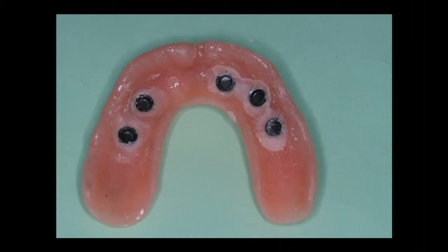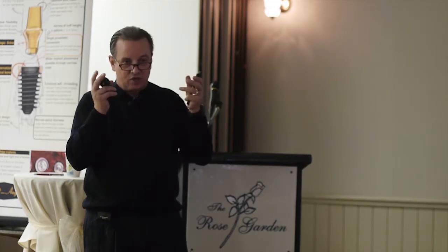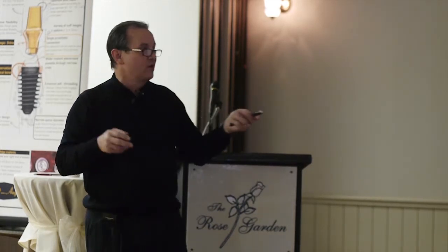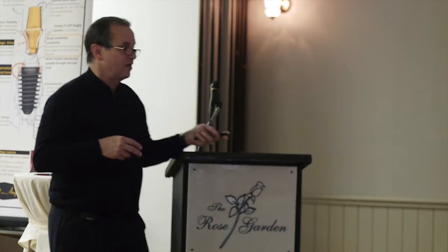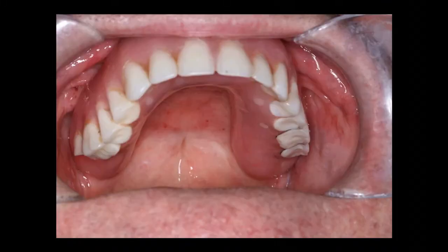And there's a bunch of stuff out there. Zest even has a product now that you can use to cure in attachments that's light cure. We just go back to using acrylic. You know, that's what I've always used. This bonds real well to the housings, and it bonds real well to the base. So we just kind of stick with that. Remove all that flash, and we're done.